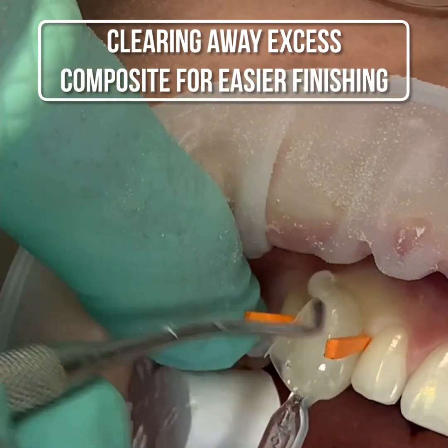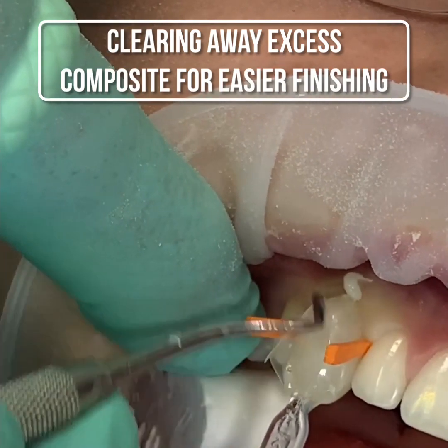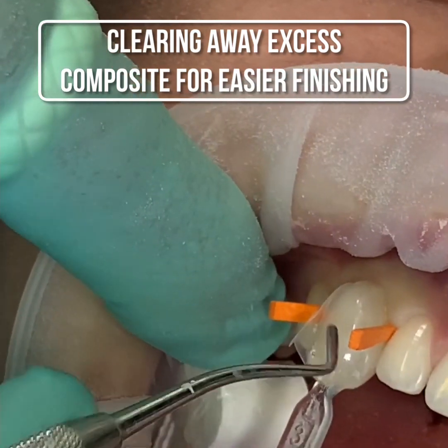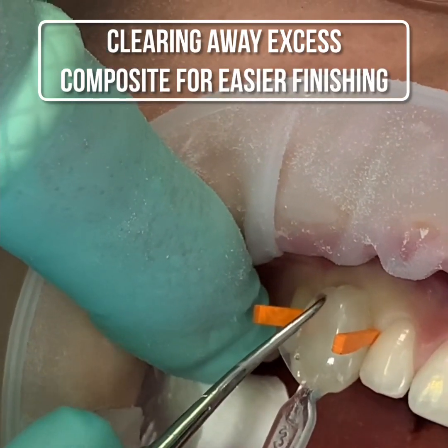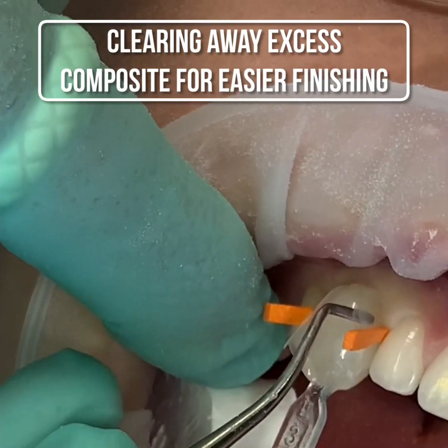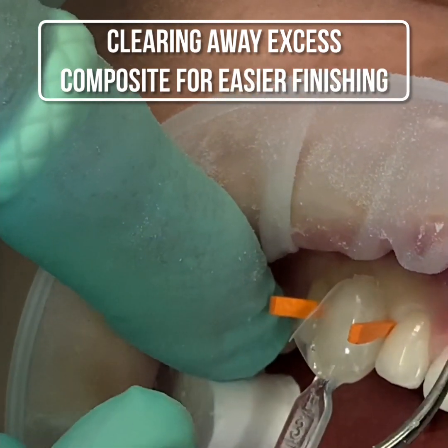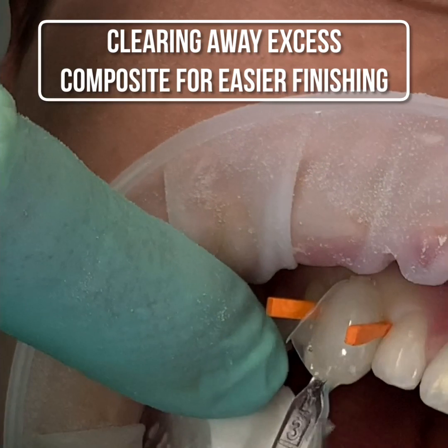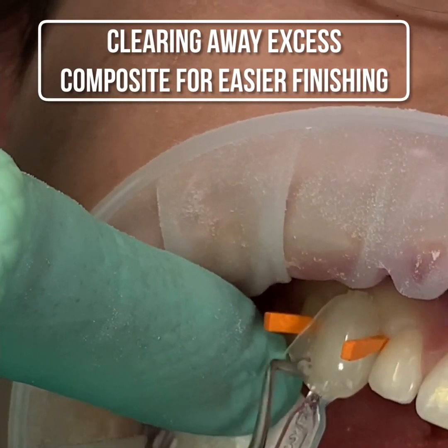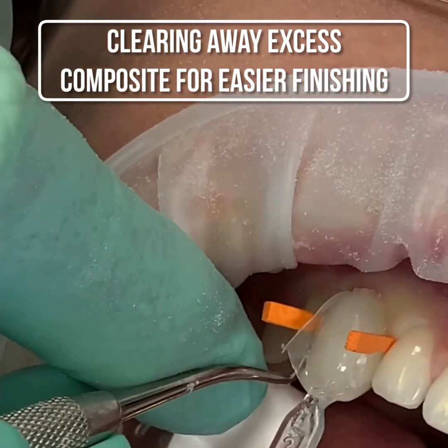I do some more cleanup, and it shows how easy it is to do a direct veneer without having to do over-injection molding and then having to disc back, reshape, look back at your restoration, start adding some primary contouring, and then finish and polish it like a whole tooth.